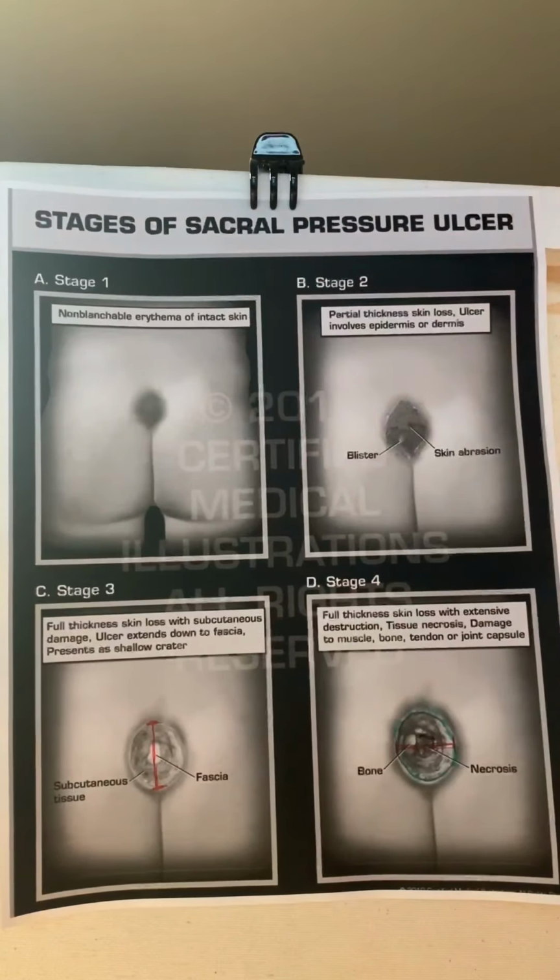Usually what you see is the ruler that is printed on the back of a gauze pad, or one of those actual tape measures. In this instance, we're looking at how digital wound measuring can provide accurate, consistent measurements, not just between the same nurse, but across all nurses that are measuring the same wound.